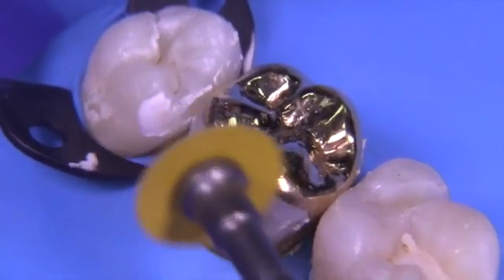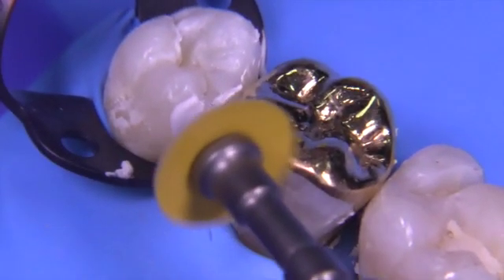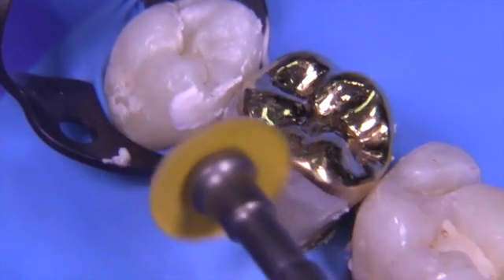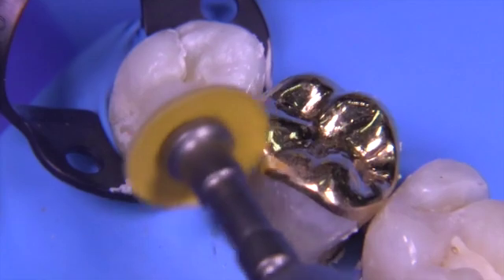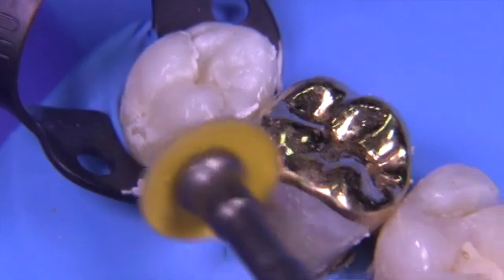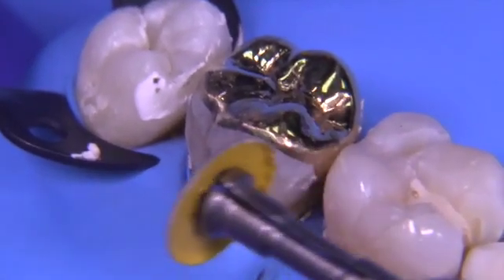Now we're going to use a medium garnet disc, rotating clockwise — from gold to tooth — and that's always the way we want to do it. Dr. Tucker always said this is the workhorse of all the discs, meaning it does very fast work. It's handy to start with the garnet disc because it very quickly gets the tooth and the gold to the same plane.